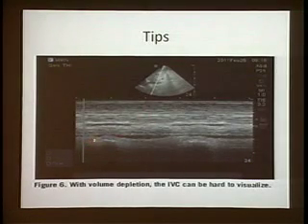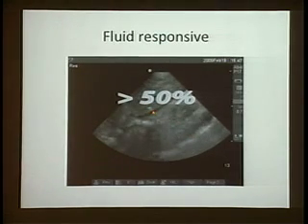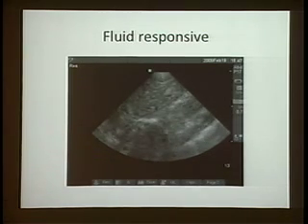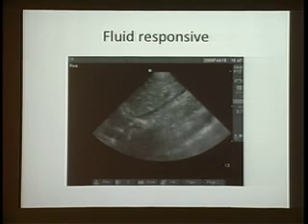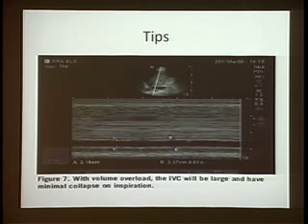Okay? So again, when you have someone that is very empty, you can see barely this change. It's hard for you to determine what is what. And you can see then the amount of time the vessel remains collapsed. And then also give you an idea whether you want to give this patient fluid. This should be similar to some of those algorithms that are using pulse pressure variation or any dynamic indicator of fluid responsiveness. This can help you too.